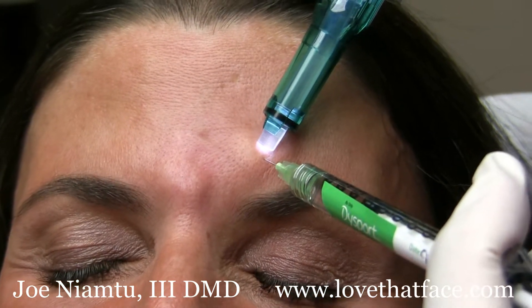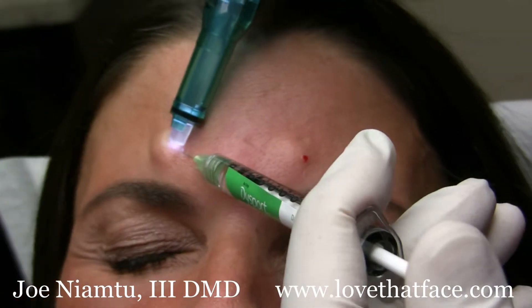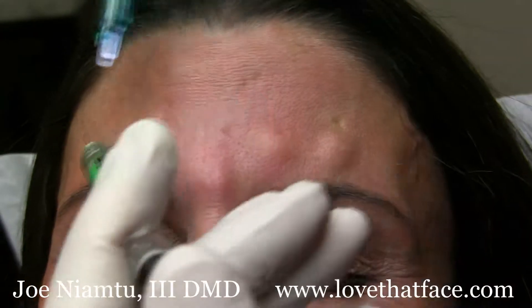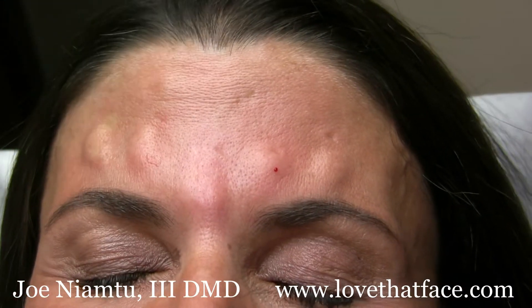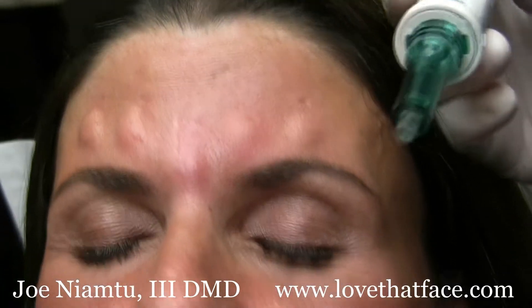You can press down on it a little bit and it helps light up the area. There are various vibration devices available on the market, but this has a special technology where it pulsates. I've used this and it really makes a difference in the pain control when we're doing these procedures.